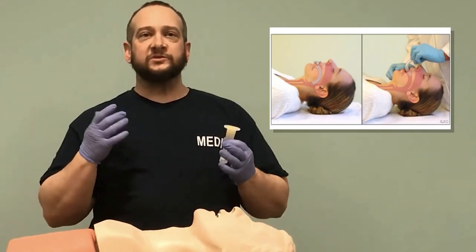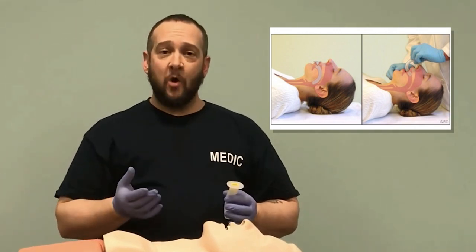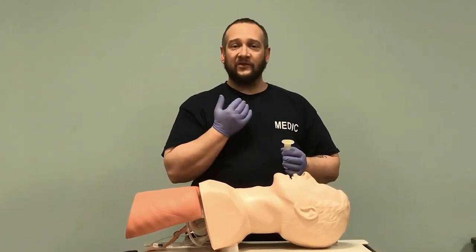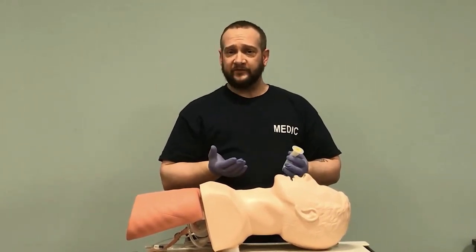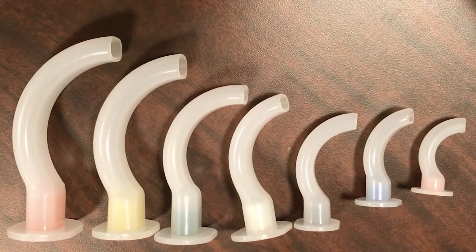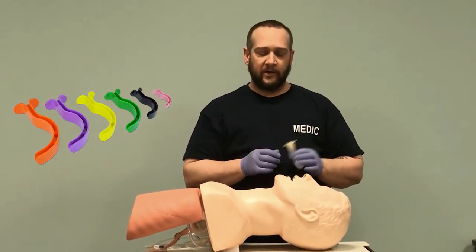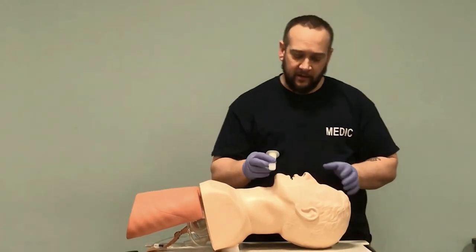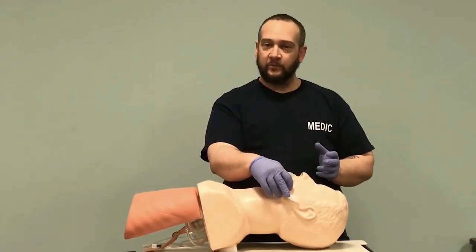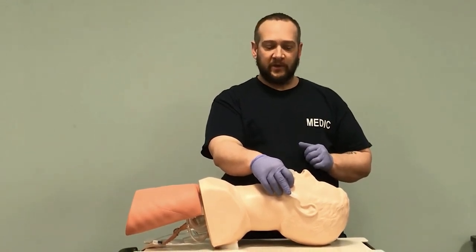If the OPA is too big, it could go back and actually occlude the airway. If it's too small, it won't do the job — the tongue could still fall back because the device wouldn't hold it in place. OPAs come in all different sizes, so you measure against the patient and make your best determination. If the patient falls between sizes, use good clinical judgment as to what will be best.